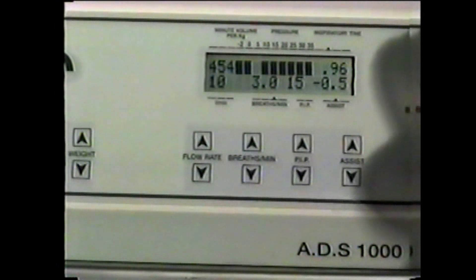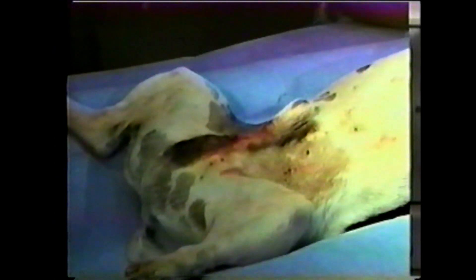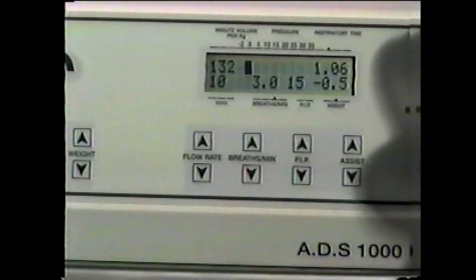Notice that the background of the ADS display has now changed from light to dark. This indicates that the patient is initiating the breathing cycle. When the cursor is dark on a light background, this indicates that the ADS is controlling the ventilation. As the ADS delivers each breath to the proper peak inspiratory pressure, you will notice the patient's chest rise and fall in a steady fashion — this is also an indication of proper ventilation.